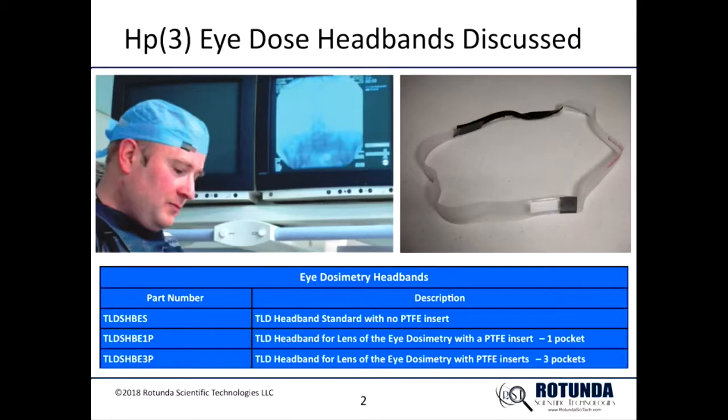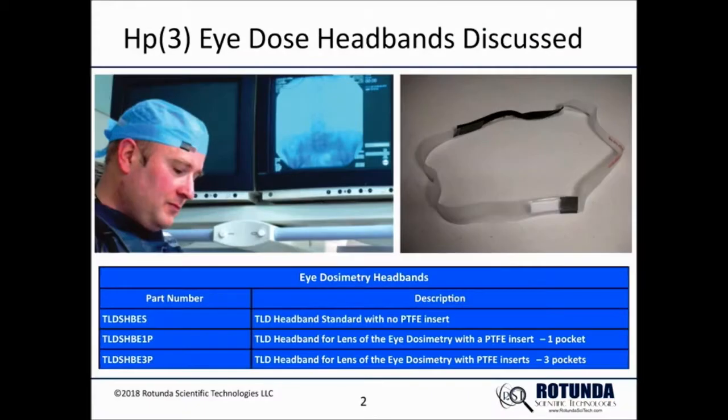This is the headband with one pocket, shown by part number TLDSHBE1P, or TLD headband for lens of eye dosimetry with a PTFE insert, one pocket. Part number TLDSHBE1P is a replacement for the previously mentioned headband where the PTFE insert is reused while disposing of the headband.